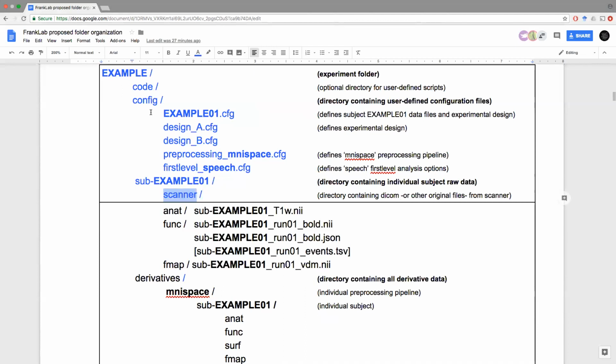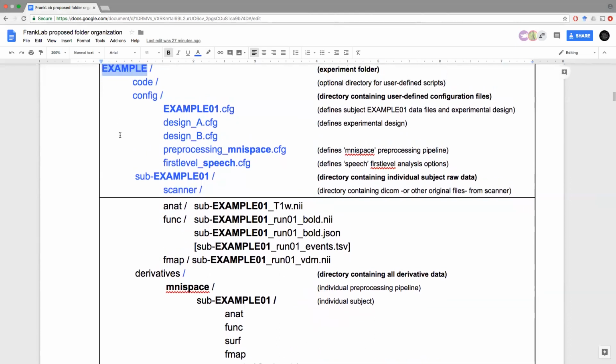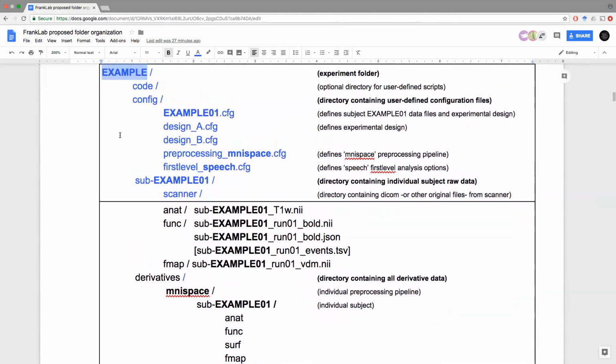At that level. So here you mean, like, an example and have something called FreeSurfer that contains all of the FreeSurfer stuff? Yeah, like FS data or something like that. Well, right. The other option would be some repository of the FreeSurfer data.